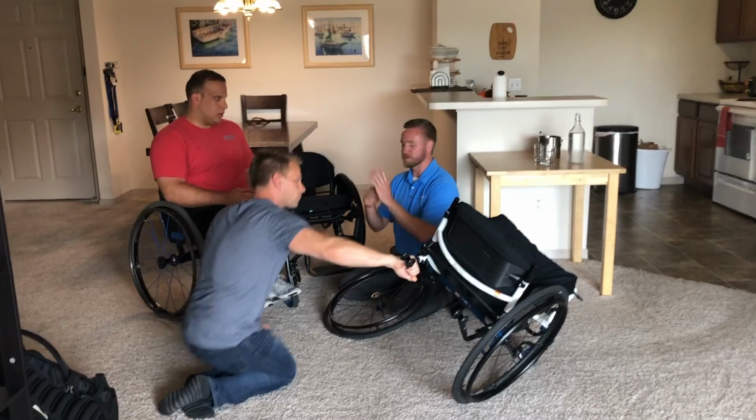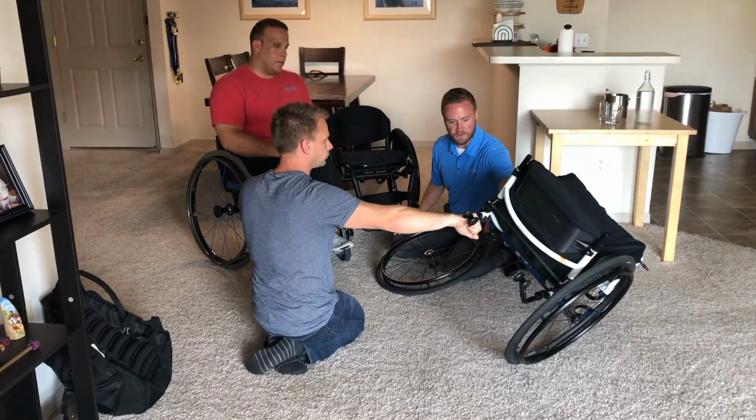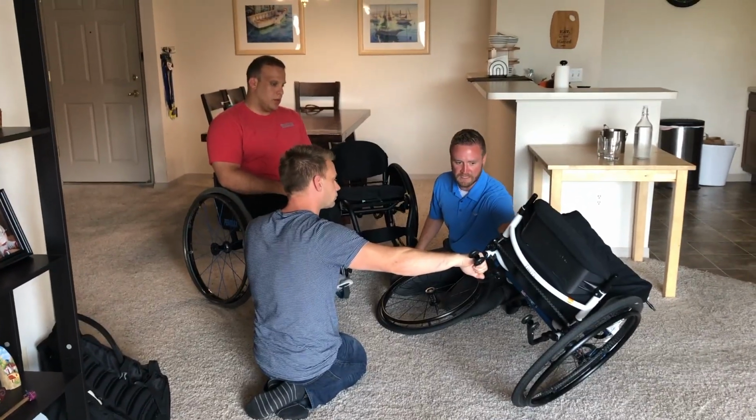And then we try to get that approved through insurance with the help of an occupational therapist or a physical therapist. We run all those items through insurance to try to get approval by medically justifying them, and then we order the final equipment, do the fitting, and tweak anything we need at that point. And then the client would have that equipment for at least 5 years after that.